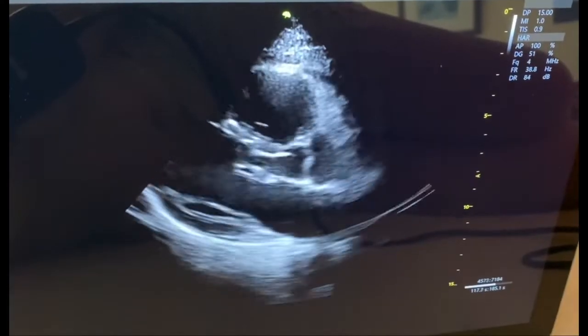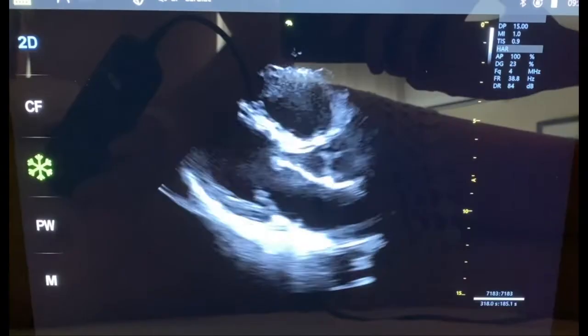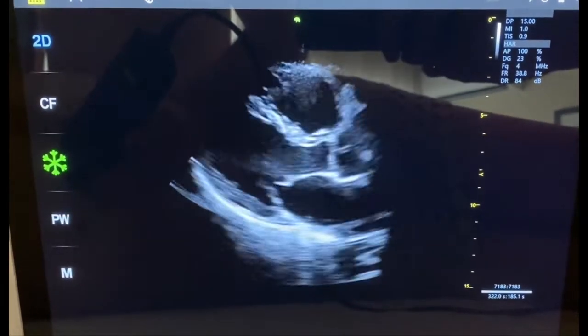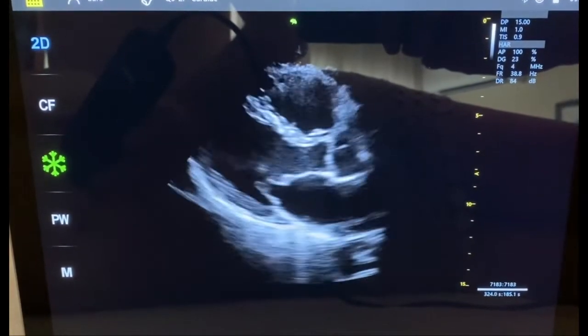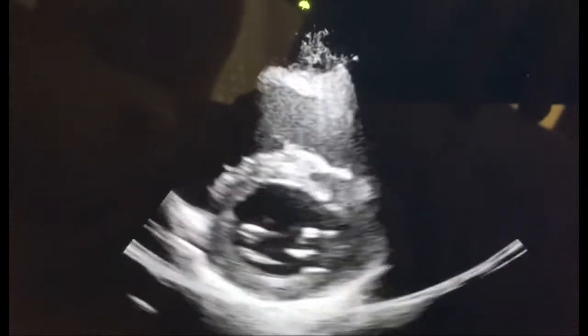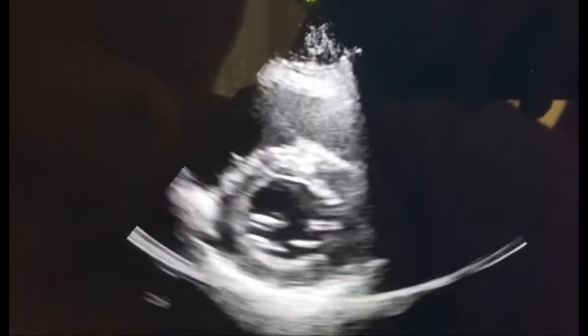And finally, these are some views from the observer's point of view in front of the tablet. This is a parasternal long axis again with sharp endocardium borders. This is a high parasternal short axis seeing the aortic valve. This is a low parasternal short axis seeing the papillary muscles on the bottom of the left ventricle, and this allows us to see the mitral valve.